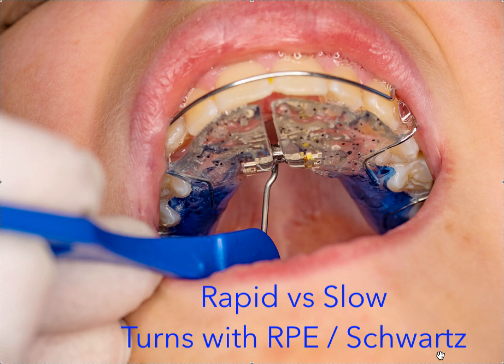You cannot ghost your patient. You cannot lose your patient, because weird, scary things can happen if you lose that patient and they keep turning, okay? So you need to train your staff, and also perhaps have a list, run a report. I don't care how you want to do it in the back office, but if someone doesn't come back in, like I've even had a notebook in the back office with names or initials and the date we put the expander. And if they don't follow up, that's a problem.